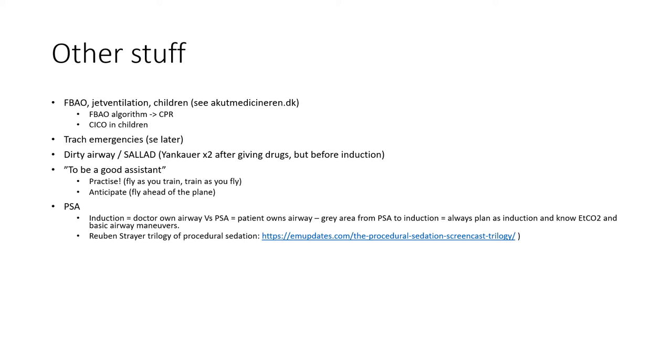When we give our sedation drugs, you have prepared the sedation as if it was an intubation. You may not have unpacked all the stuff, because it's rarely needed, and it will be very expensive if we have to unpack all the stuff for intubation every time we do a sedation. But you will at least have it at bedside so that you can quickly do what you need to do if they lose their airway and do some measures there. The thing with sedation is that usually it's just temporary.